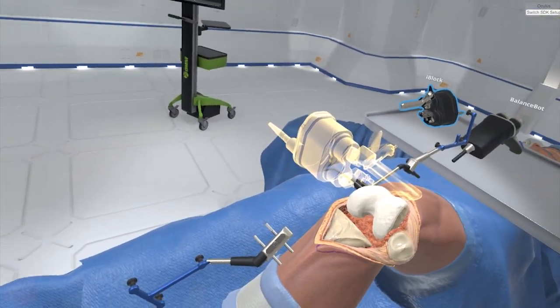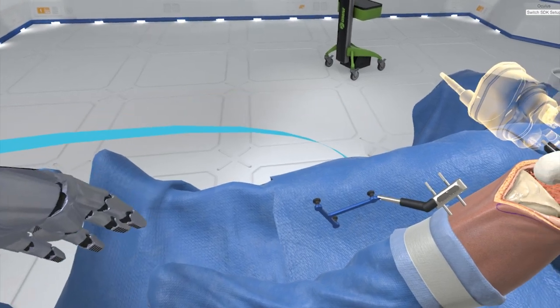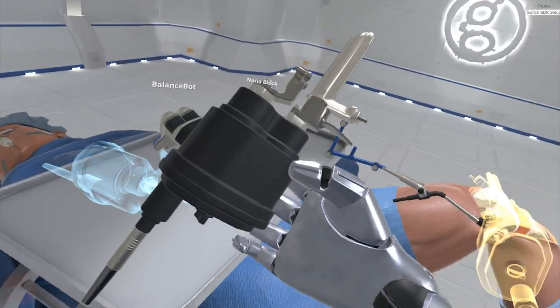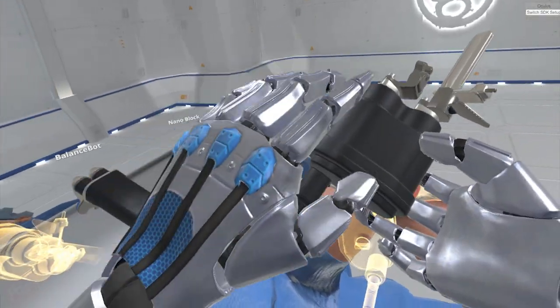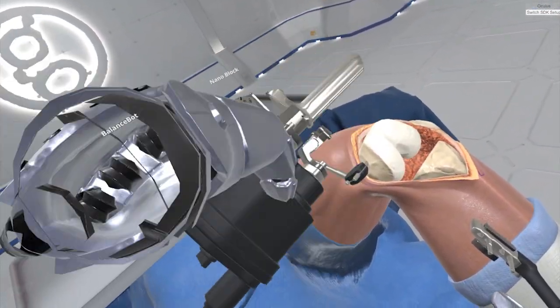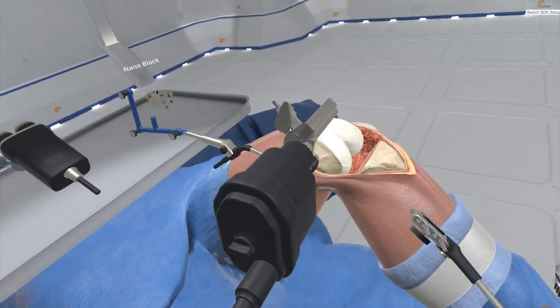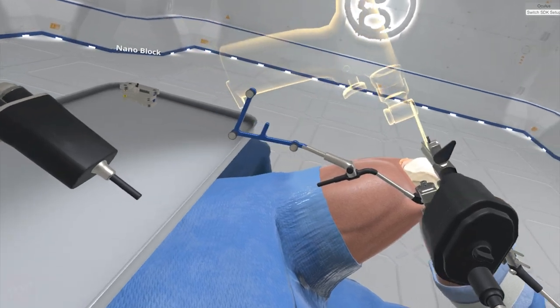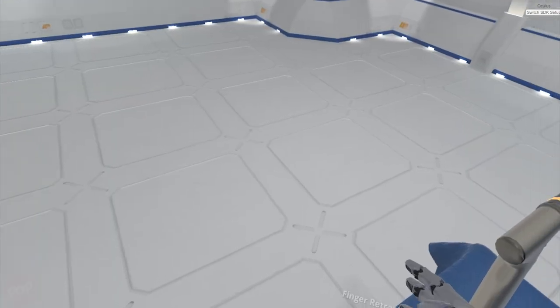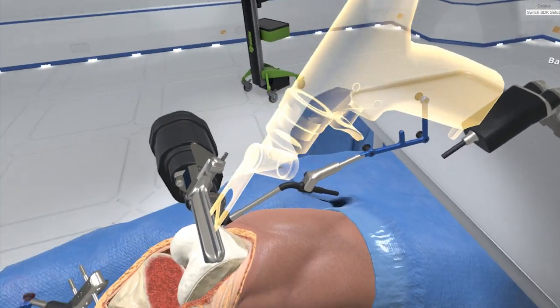Grab the iBlock. The iBlock guides the femoral resection. Attach the iBlock to the femoral fixation base near the femoral target array. Observe the iBlock automatically adjust to create the distal cut. Grab the bone saw and place the blade into the resection guide to make the distal cut.